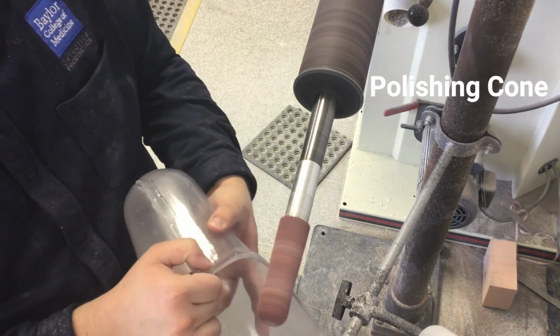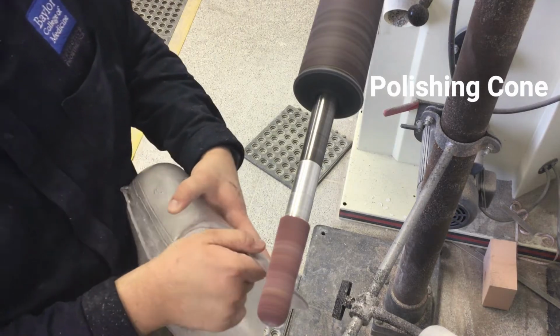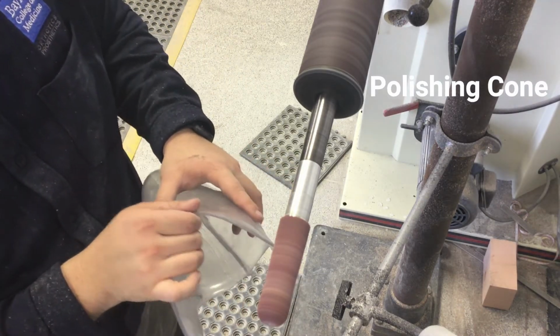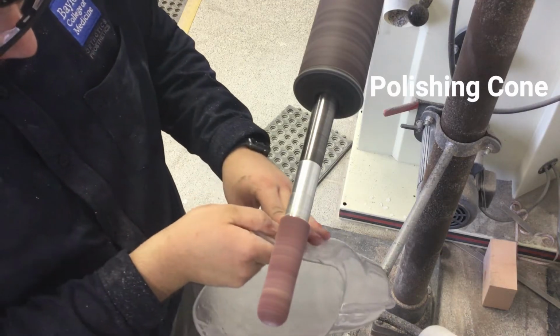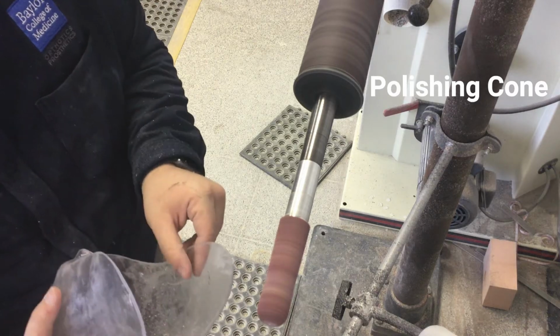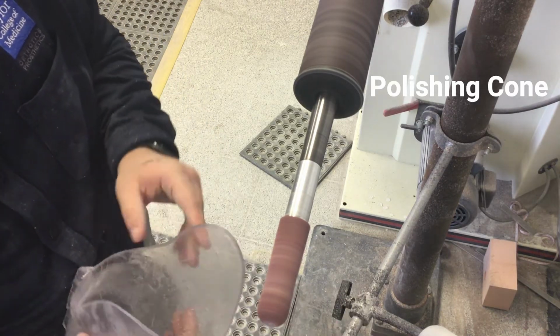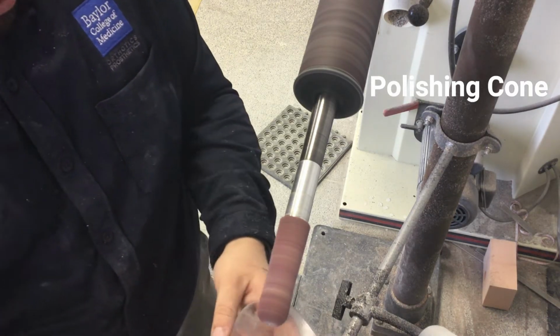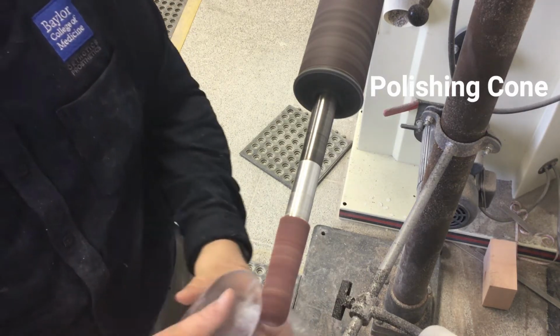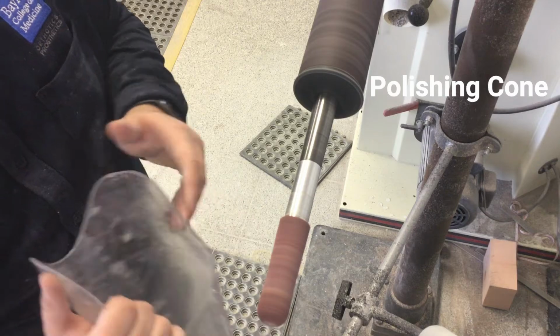Gentle, long pulling motions with this cone will allow for the longer use of the cone and better contour around the trim lines. The polishing cone will give the socket a nice aesthetic appearance and touch for the patient and the long-term outcomes of the socket.